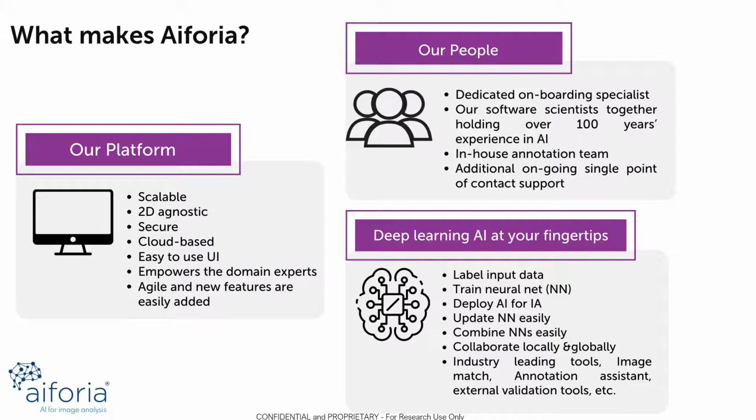And so our science specialists do range from vet pathologists to cancer biologists to microbiologists, neuroscientists, engineers, etc. We do have an in-house annotation team, so in the event that you don't have the time to build your own AI model, you can outsource that to us. And then we definitely have additional ongoing single point of contact support.